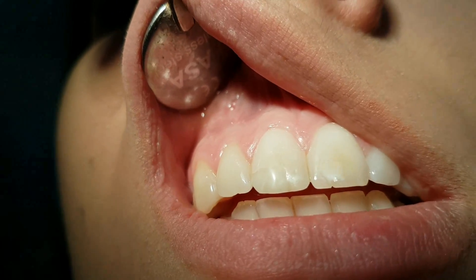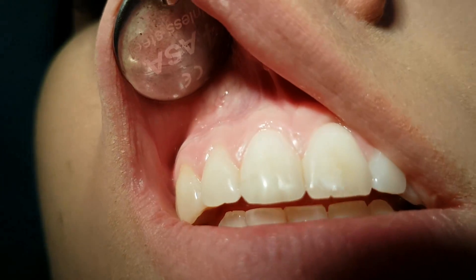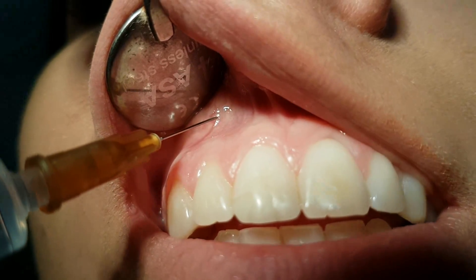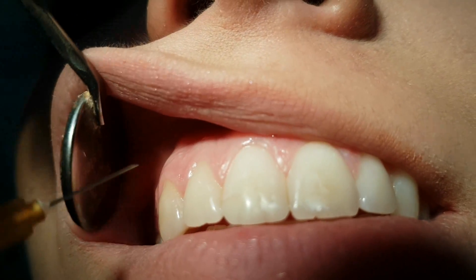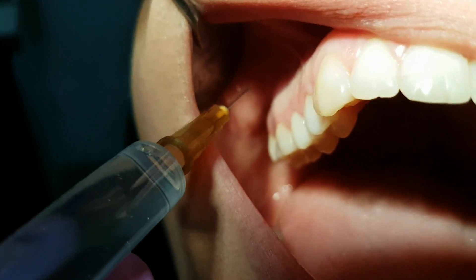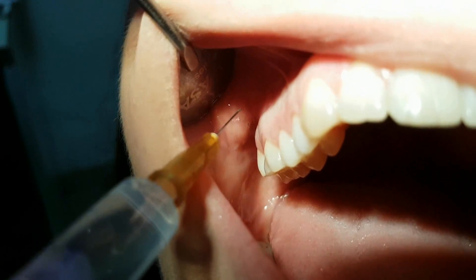At the level of the foramen apicale of every tooth, we set the needle at 45 degrees. We go into the mucosa until we get contact with the bone, check if we are in a blood vessel, and then apply the local anesthetic.